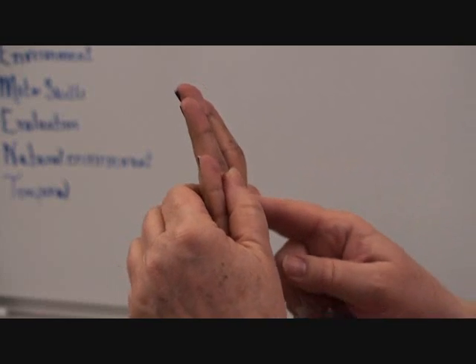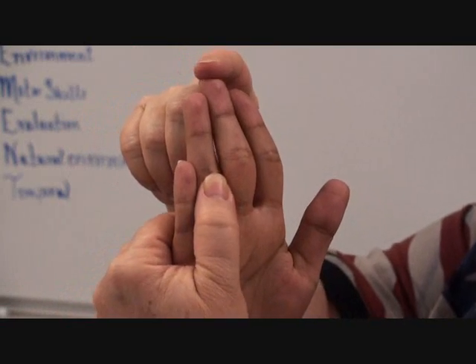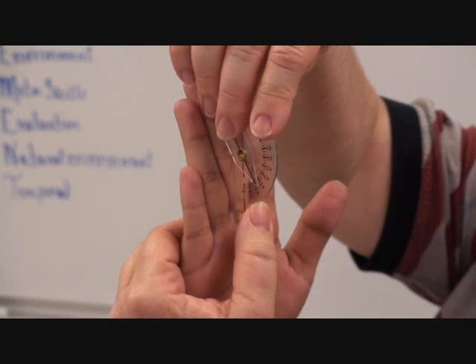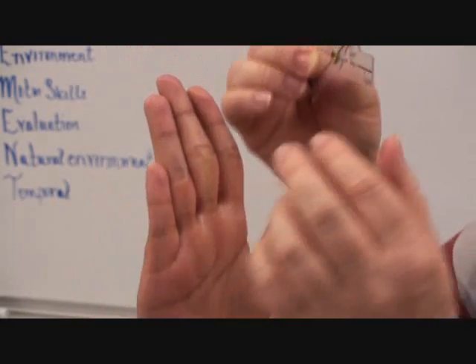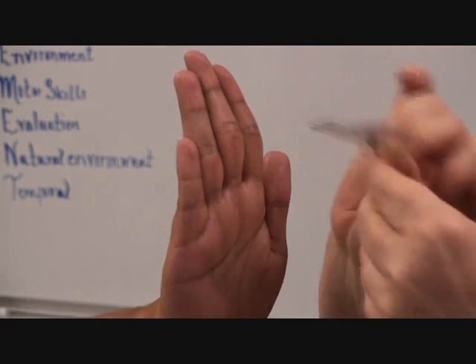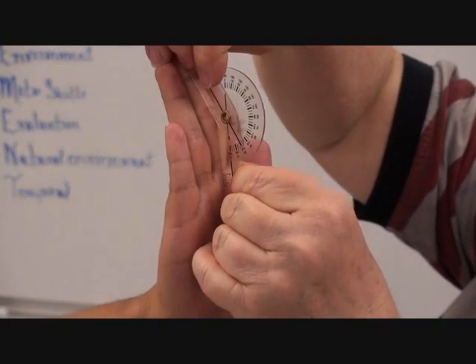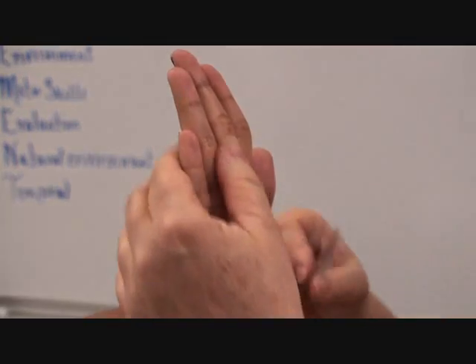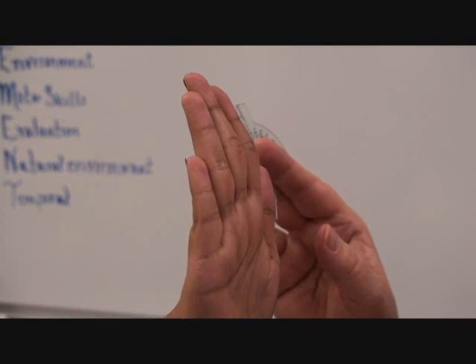Okay. So I just wanted to show you this hyperextension. I don't know if this, can you see this angle back? So you see how hyperextended, especially these two are? We actually were able to come over the back here and measure almost like we were measuring flexion. So she's got well over 30 degrees of hyperextension there. We've got like 38, 38 hyperextension at this middle. So here at the next finger IP, and then here at the index finger, it's about 30, 32. So I'm going to try to get a couple different angles here so that you can see. So something like this, you would want to actually measure with that much hyperextension.